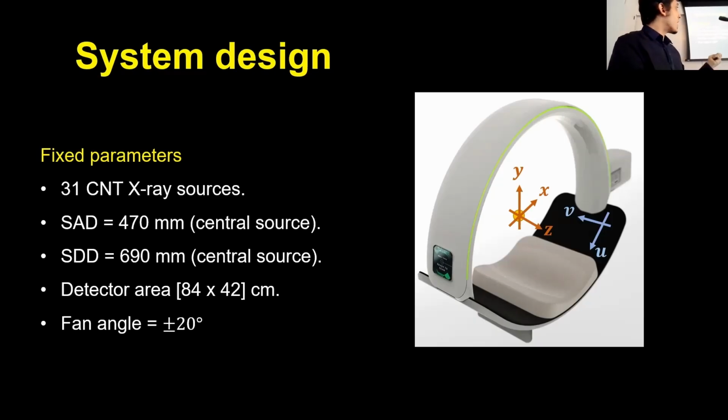But also one of the improvements here, even including that simple rotation, is that the mechanical complexity of a single rotation is lower than a total rotation gantry rotating 360 degrees. So in this case, we wanted something as static as possible to include the lowest motion we can achieve. But of course, other approaches like yours are also possible.